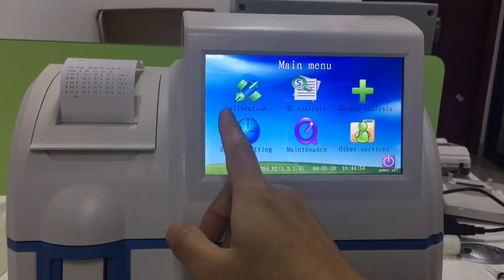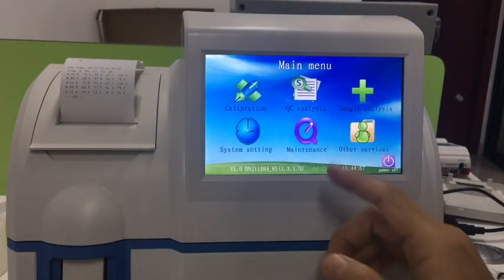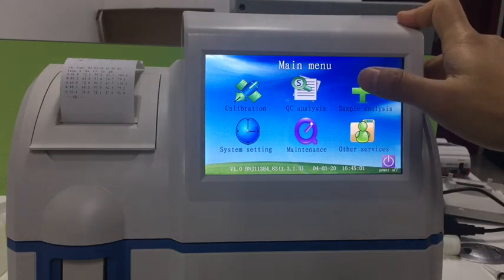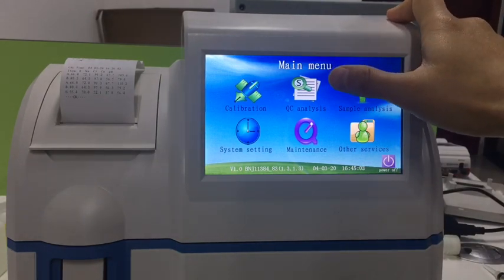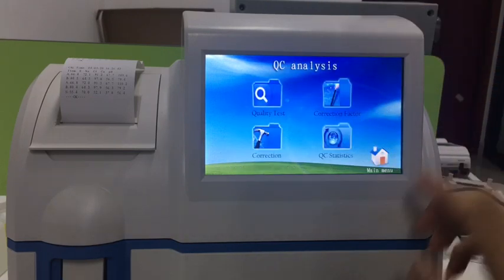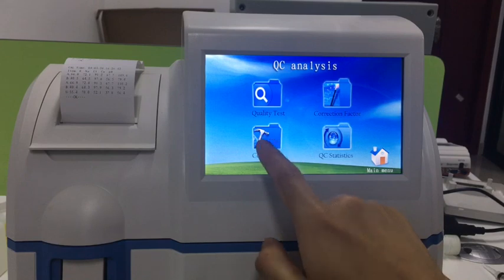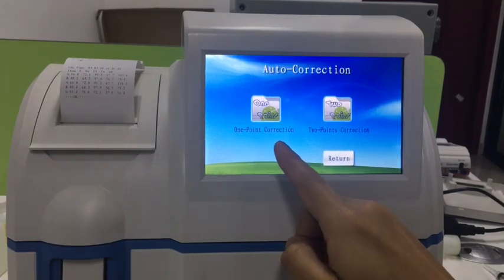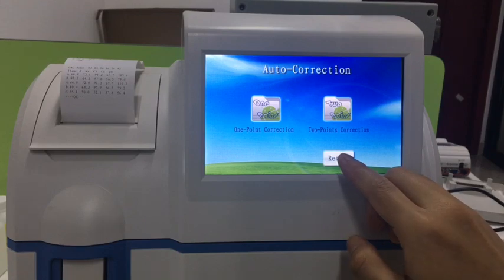When you feel the result is not good, you need to do the calibration. Sometimes you need to do quality control to make sure the machine is working correctly. Here you can also do one-point corrections — I will show you later.